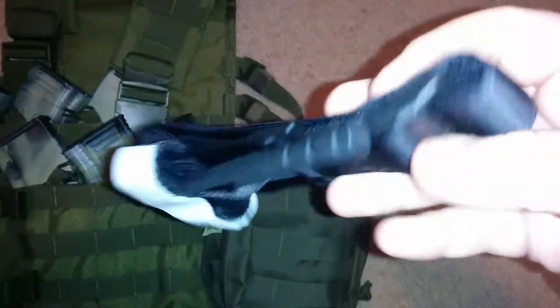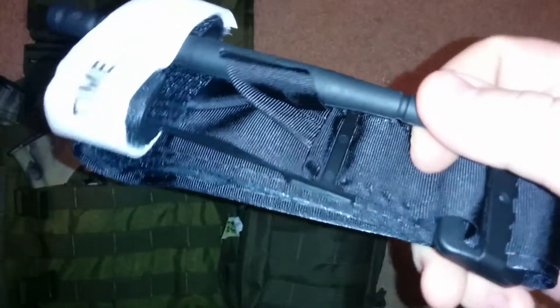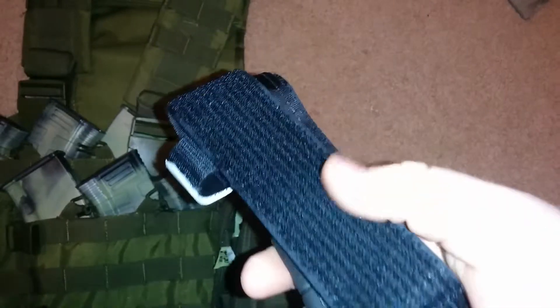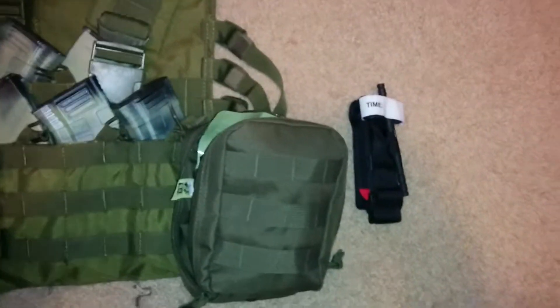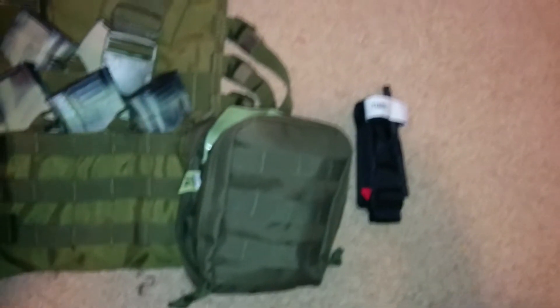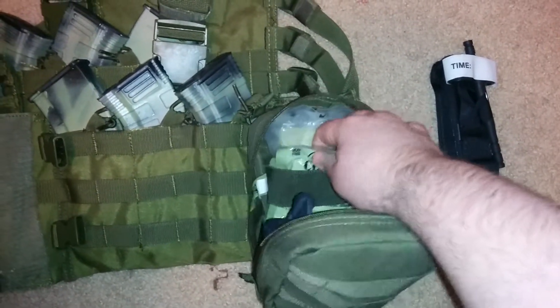As soon as you open it up, there's a CAT tourniquet in there. I think it's very important to have one of these, because if you get shot in the leg or cut an artery, and you can't stop the bleeding, you need a tourniquet of some kind — whether it's a homemade one or an actual CAT tourniquet. You can also make an improvised tourniquet with a belt or anything you can tie around an arm or a leg. I plan on getting maybe two or three more.